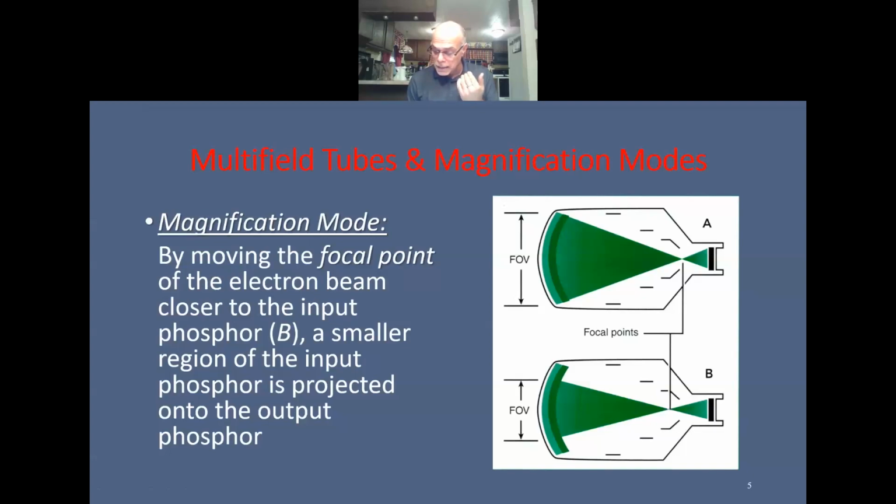But it's incredible. It says in the next column, you will see that these increases in patient dose will be significant. They can be as high as 3 or 4 times the normal exposure. So from going from a full input to a smaller input to get the magnification mode, your patient exposure is going to be increased by a factor of 3 or 4 times more. So in the magnification mode, you get a weaker image. The ABC corrects it by amping up your MA. Patient exposure goes up. You get better resolution.